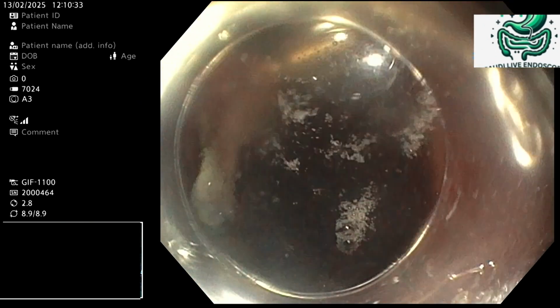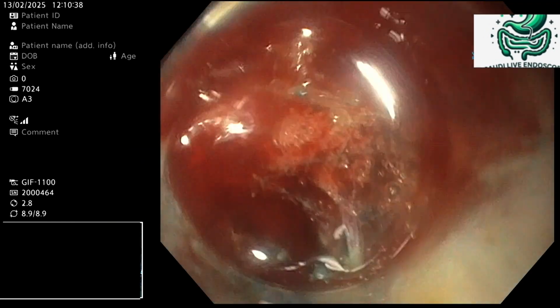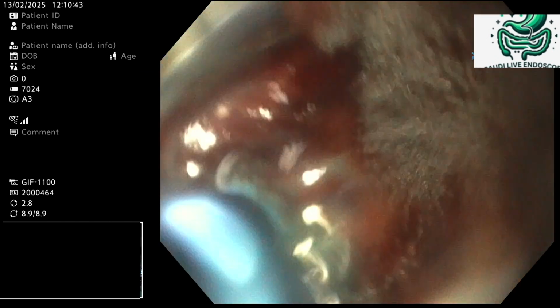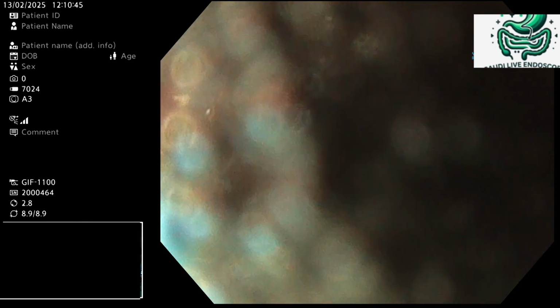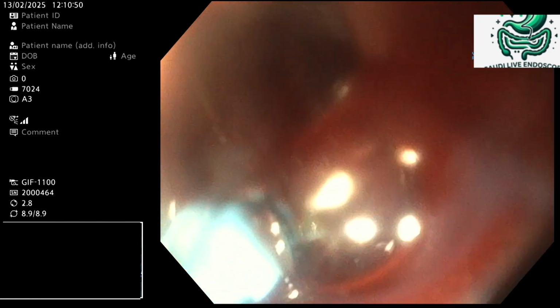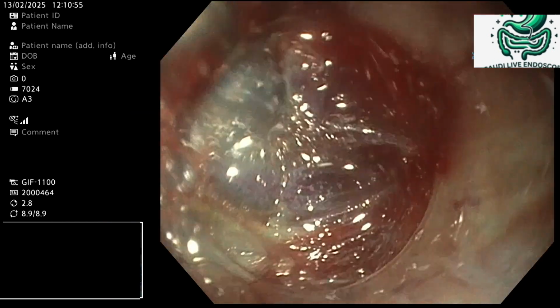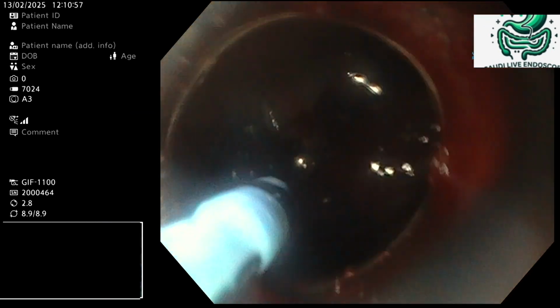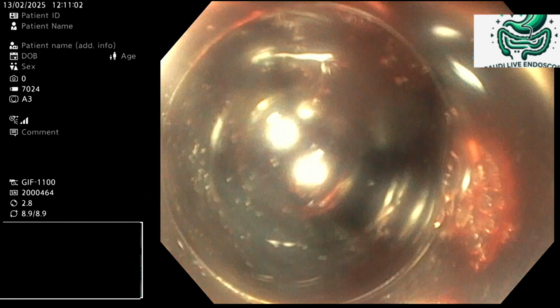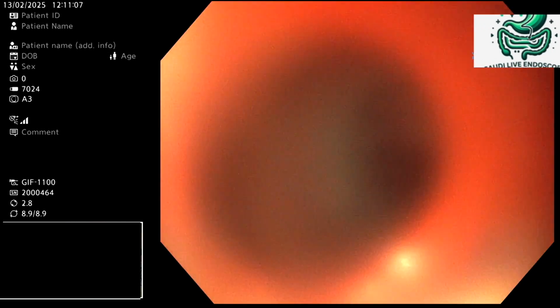Look, we were just discussing yesterday with my dear friend and colleague, Dr. Despot, on the plane. In our center, we have R0 resection in 86% of our ESD. For recurrence, we only had one, and this was because of R1 lateral. If we have R0 resection, our strategy is a 1 year follow-up colonoscopy. Just to add one. Any other question from the audience?